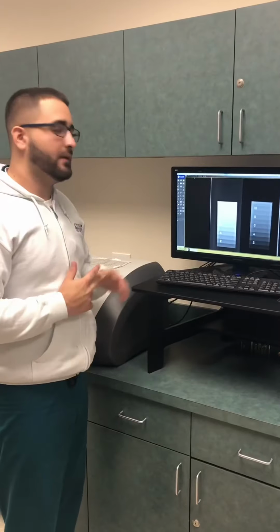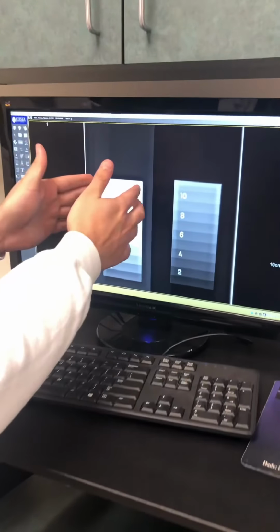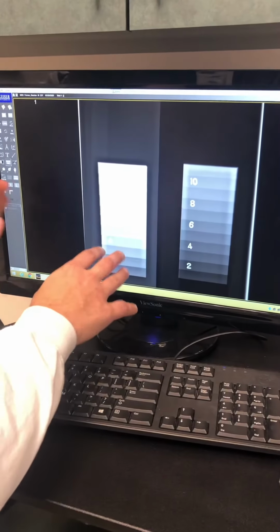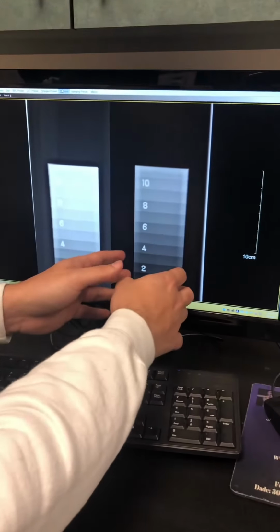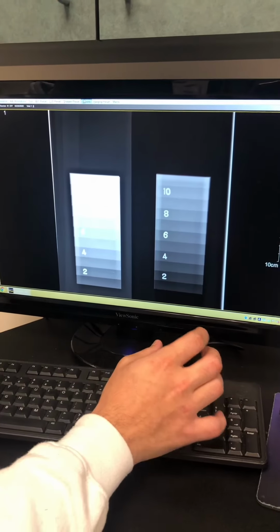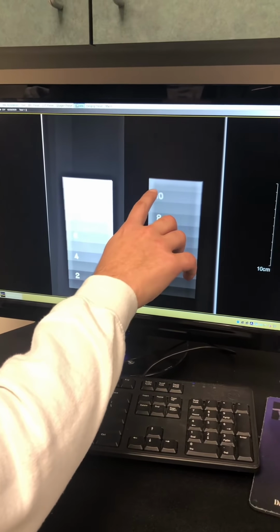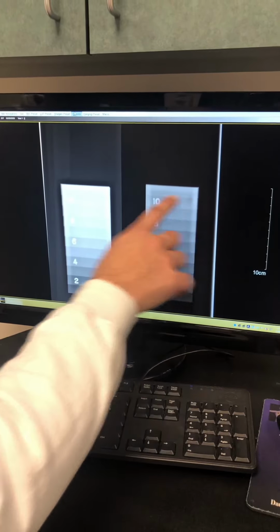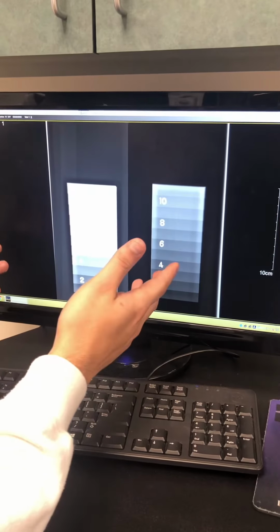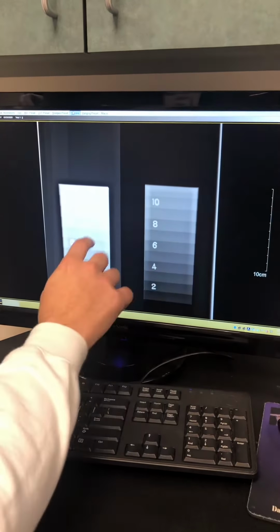X-ray. So as you guys can see here to the left, this is when I used the kVp at 80. As you can see the difference between that and the one at 120 kVp, which is a lower contrast, you can tell the difference between the tissues. So if you look at number 11, when I use 120 kVp and at 80 kVp, it's a big difference. You can see it more clearly here than in the 80 kVp. So in order to obtain high contrast, we have to use low kVp.